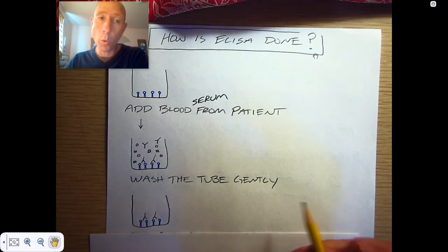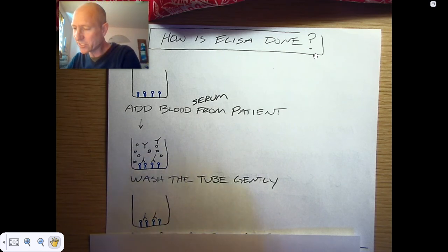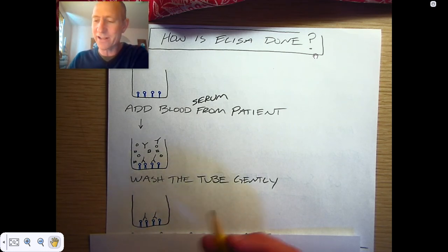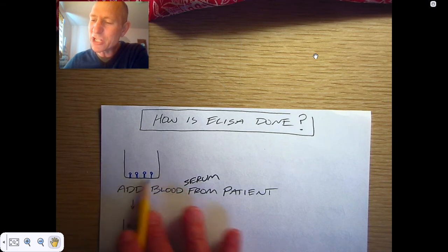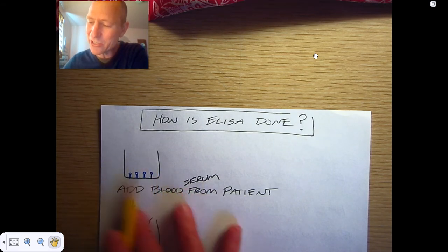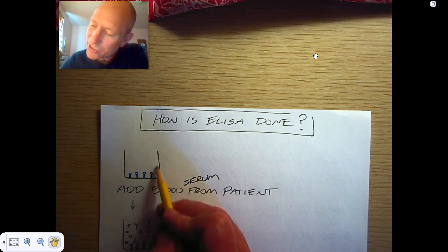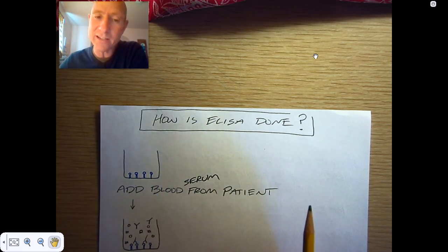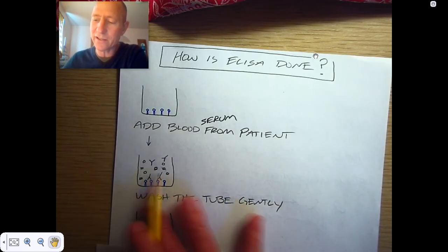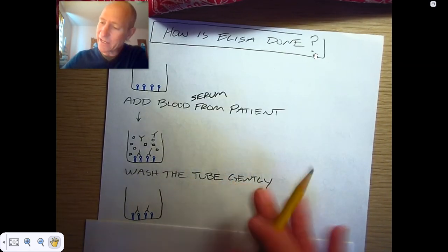And you're going to be like, well, Mr. Gator, you said proteins are attracted to this plastic, so why didn't all that junk just stick to this plastic? And it's on account of, I didn't tell you, one step you do after you bind this is you add a bunch of milk to your test tube, because milk is a cheap source of protein, and the milk proteins just stick to all these places that these antigen proteins haven't stuck to, and it prevents any of this other stuff from sticking. Sorry, that was a little bit of an aside.